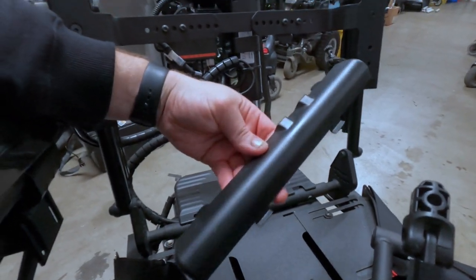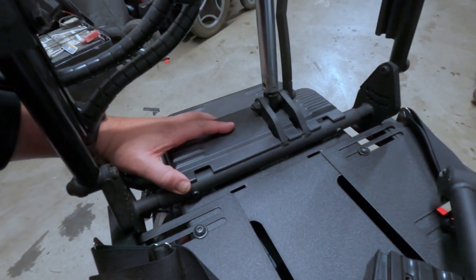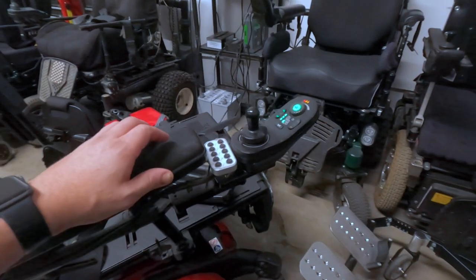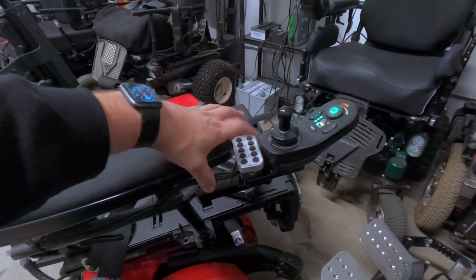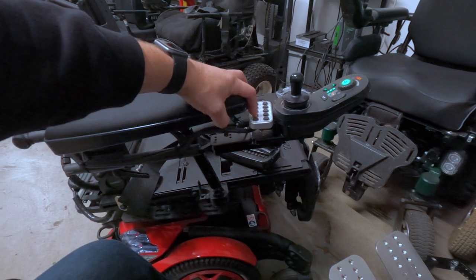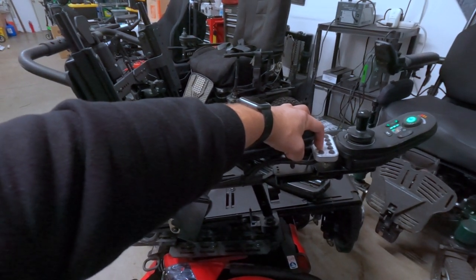This piece comes off — sounded like breaking but it didn't break. There's another plastic cover here with some screws. All right, we're getting somewhere — look at all this adjustment! This is why I appreciate people sending me messages, because for whatever reason I just didn't notice all of this last time and I was banging my head against it for two or three hours. I just realized I'm such a noob — I don't have to lean over, this thing has a seat lift on it. Let's get it up so we can actually see it and work on it.